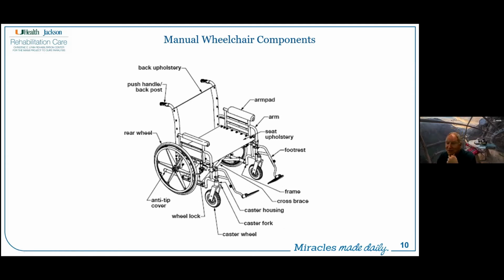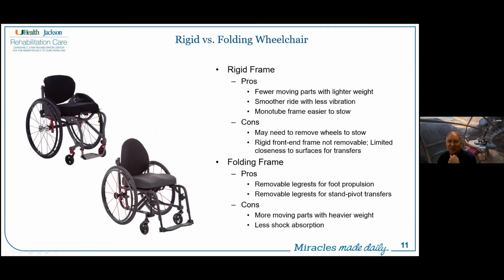Trust me, as we get to the power chair, there are even more components, but it's essential that you understand at least this so you can have the discussions with your clients as you move forward. So let's start to talk about some choices here. Rigid versus a folding frame.